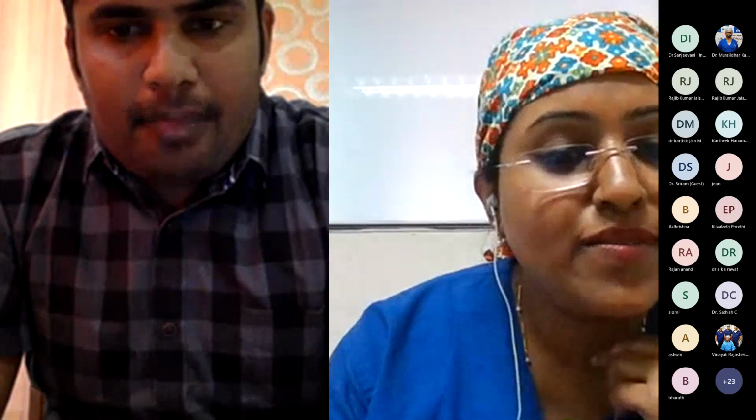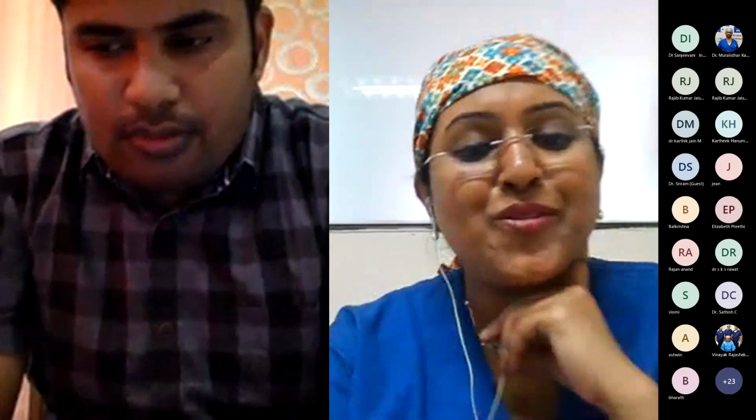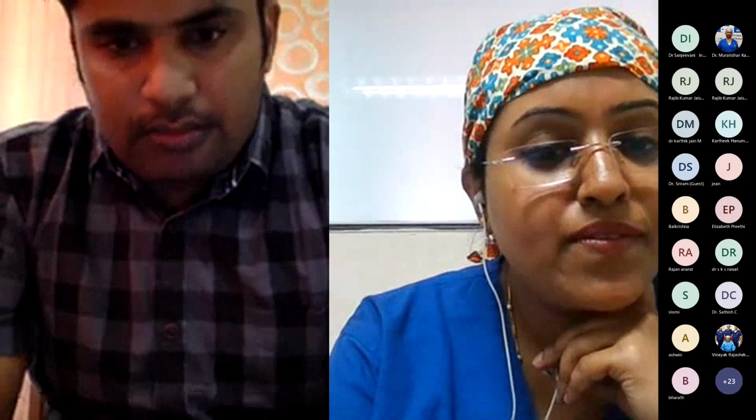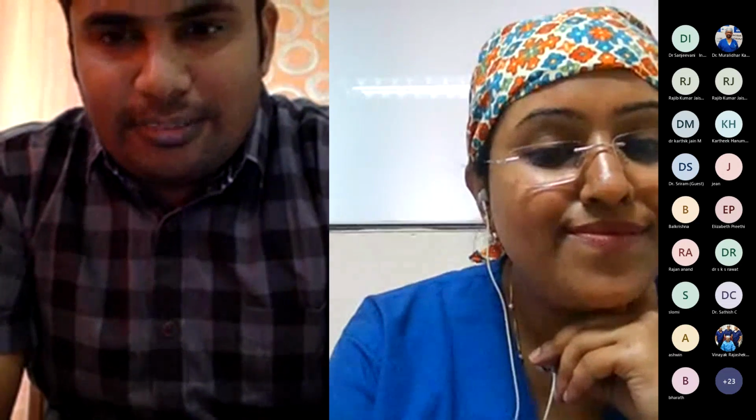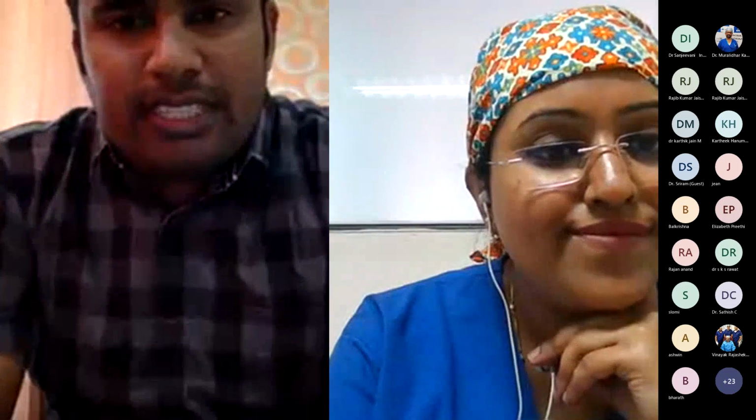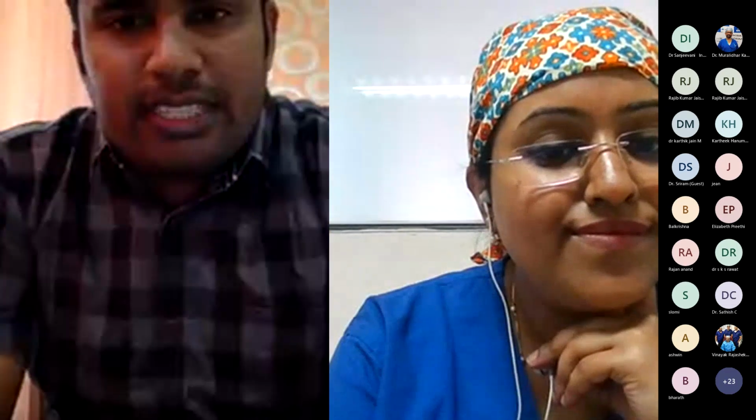Does anybody have something on LA volume also? Pooja, can I say something? Yes. LA volume also has many caveats, isn't it? Yes. LA volume. Actually, TEE is not the ideal one for measuring LA volume, to be frank.